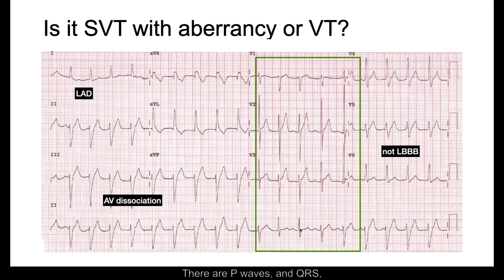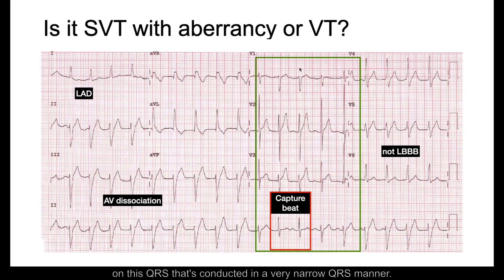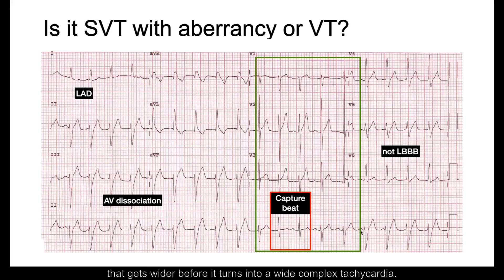Let us now focus on the transition zone. There are P waves and QRS complexes — some are very narrow, some are broad. You can identify actual capture beats with P waves seen on QRS complexes conducted in a very narrow manner. There are also P waves with a slightly wide QRS that gets wider before it turns to the wide complex tachycardia — these would be fusion beats.